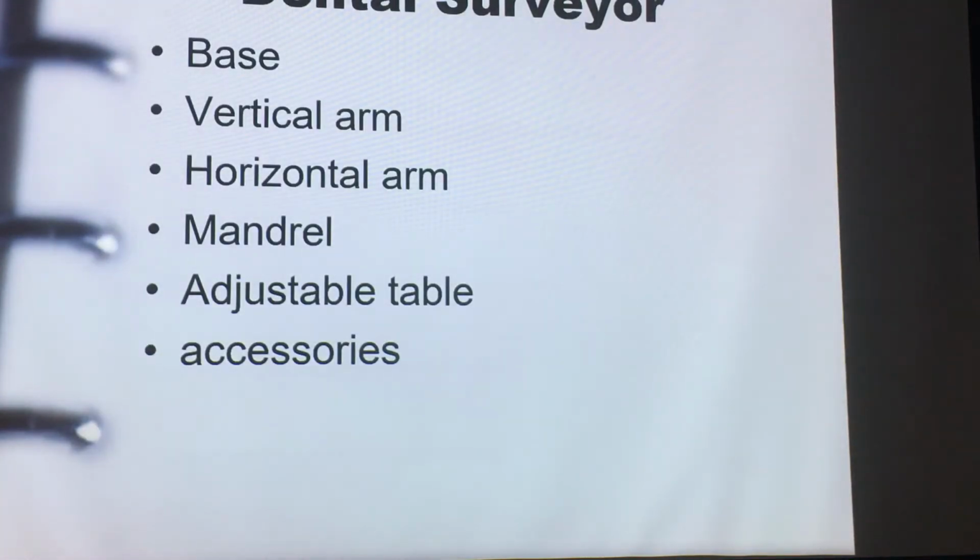We've got components of the surveyor. You'll see these visually in the practical demonstration to follow, about surveying, surveying the height of contour, and blocking out our models, blocking out undesirable undercuts, because we need to commit to the 9 reasons for surveying. I'm going to go over them here on this quick PowerPoint. You'll find this in week 4. We might move it up to week 3, but anyways, it's under the surveying PowerPoint.